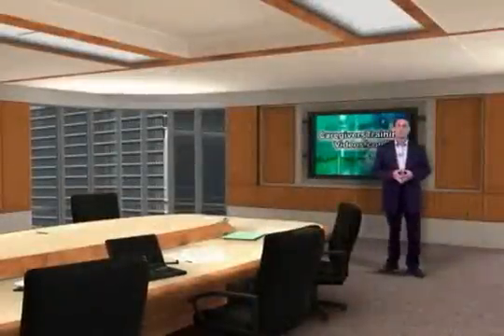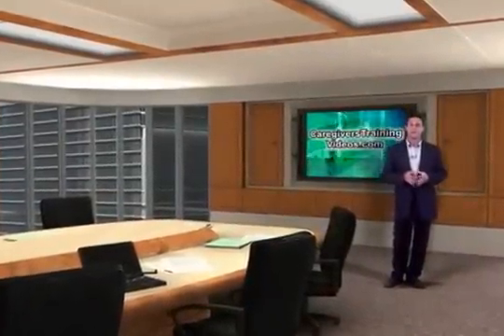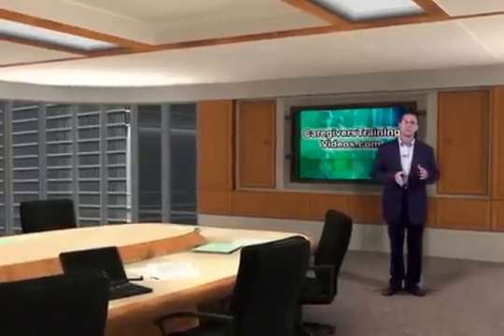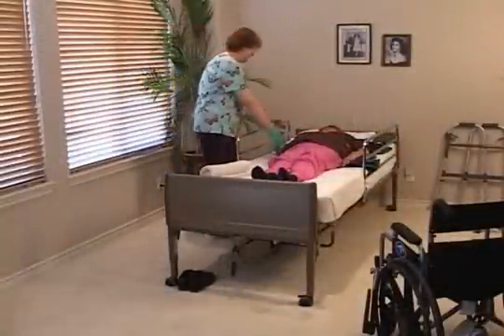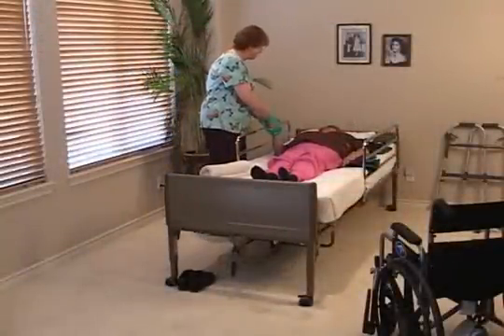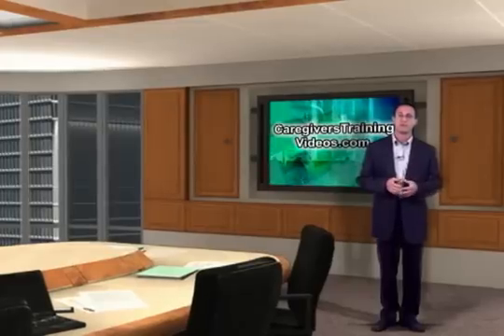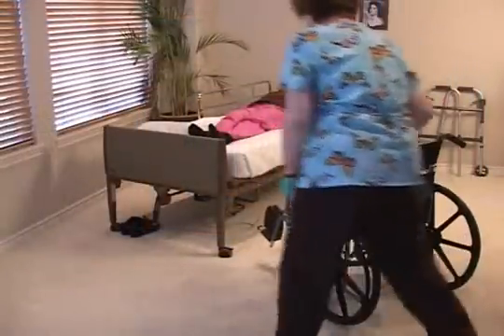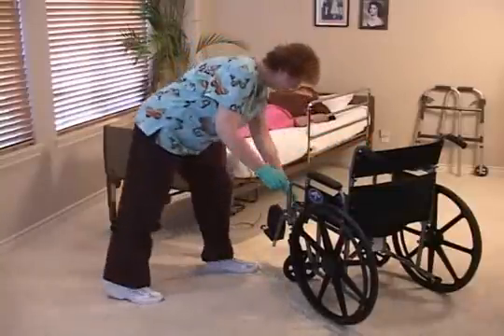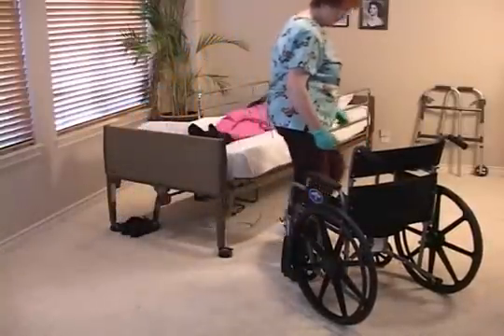We will now demonstrate how to use the full-body hydraulic manual lift by transferring a resident from the hospital bed to a wheelchair. Always explain to the resident what you're about to do. Review the process from start to finish to reduce any anxiety that the patient may have with the transfer. First, bring the wheelchair near the bed and swing the footrest out of the way. Secondly, engage the wheel lock brakes to prevent the wheelchair from moving.